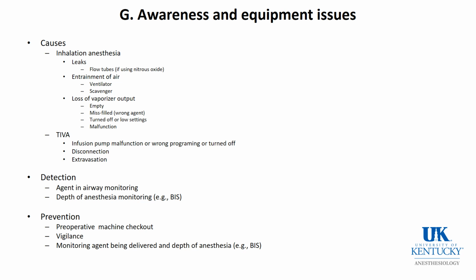I had a case about 20 years ago here, before we had monitoring. I walked in because I was called by the resident, who thought the patient was having a seizure. The patient was moving. The reason was the vaporizer was empty and the patient wasn't getting any agent. And unfortunately, the patient did have recall. I know the patient well. I've given her anesthesia subsequently on several occasions, but it's a disturbing thing. We just have to be aware of it.